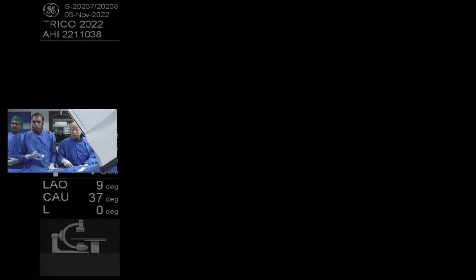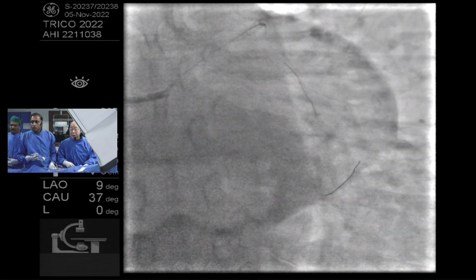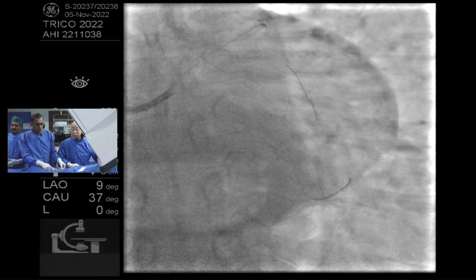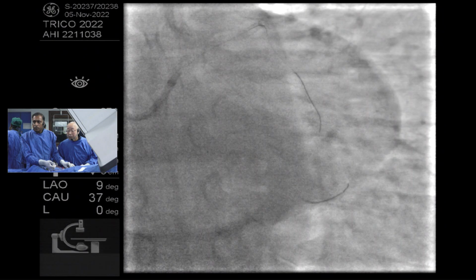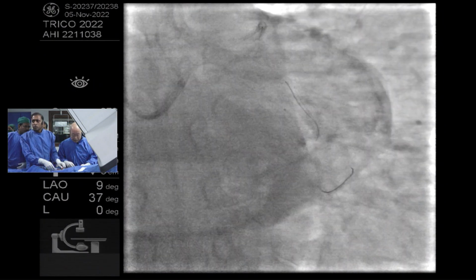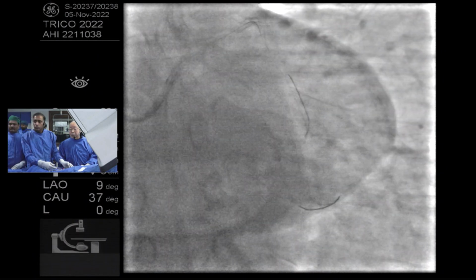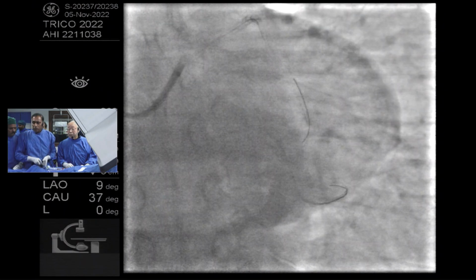Another thing to be observed here is that you have post-stenotic positive remodeling after the stenosis of the ostium of the LAD, and that happens quite often when the stenosis is significant. Yeah, I agree, but the left main is much bigger, right? As I already explained, here is the proximal LAD.